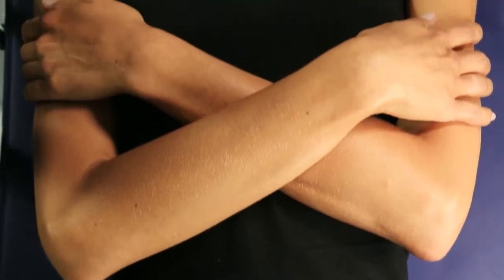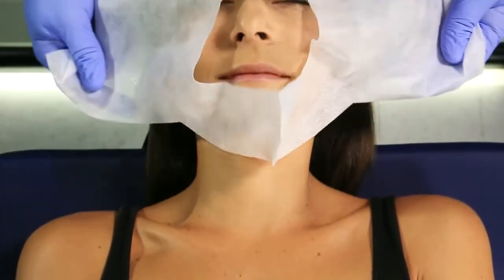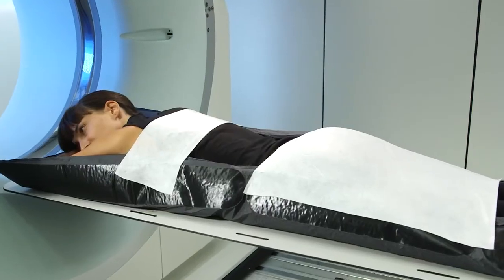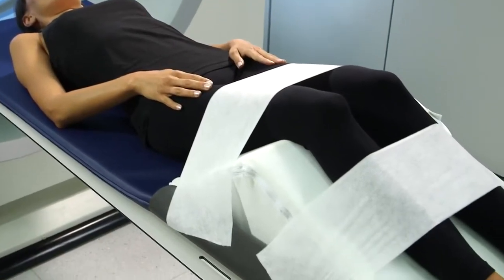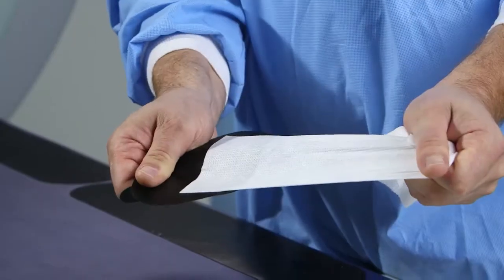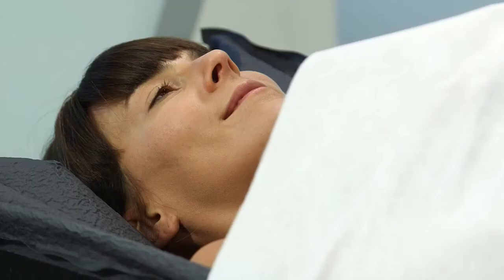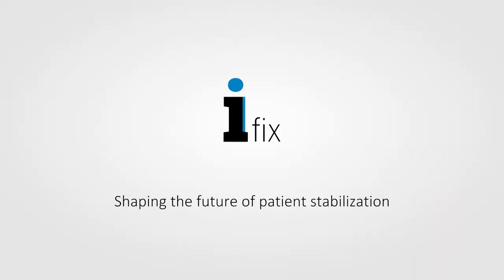The iFix system's versatile design is a head-to-toe solution for patient stabilization. It can be used for the patient's head, chest, pelvis and extremities, and is compatible with a wide array of imaging modalities including CT, MRI, X-ray, fluoroscopy and ultrasound. iFix fleece, patches and adapters form a perfect tool kit for your patient stabilization needs. iFix — shaping the future of patient stabilization.